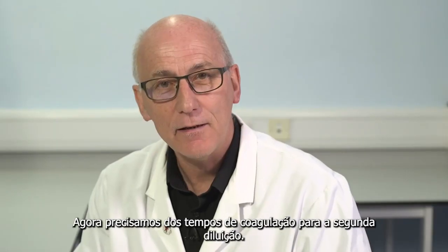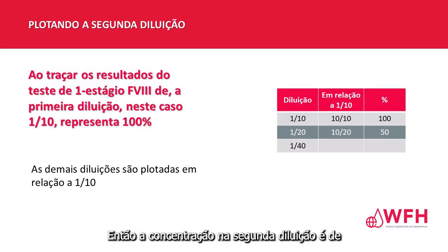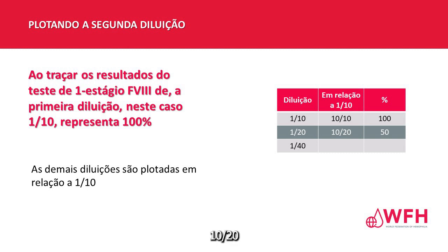63.5. Now we need the clotting times for the second dilution. The second dilution, 1 in 20. Where do we plot this? The first dilution 1 in 10. The second dilution 1 in 20. So the concentration in the second dilution is 10 over 20, 50% of the standard. It's 10 over 20 times 100, 50%. So we go along the bottom, 100, 90, 80, 70, 60, 50%. So the 1 in 20 dilutions will be plotted in this area.